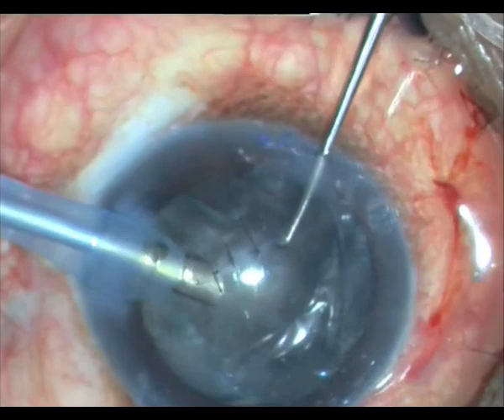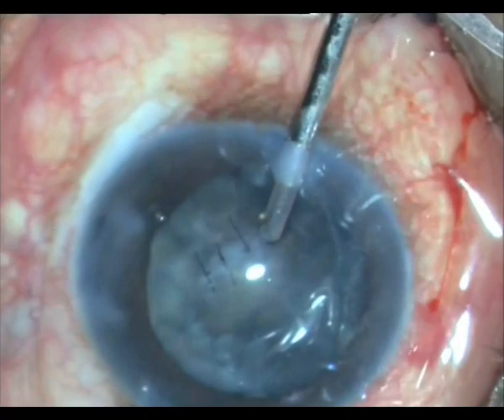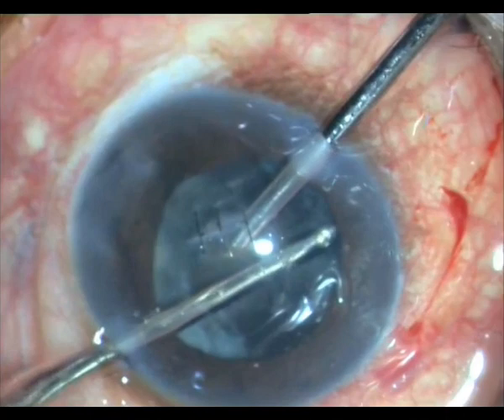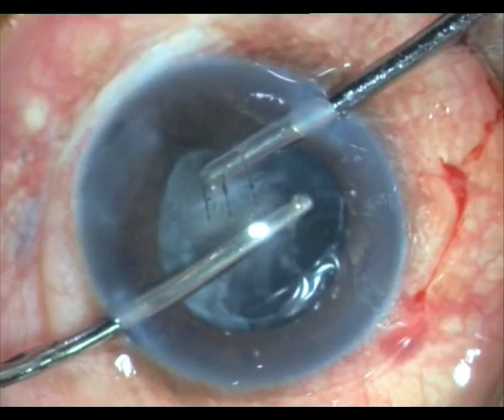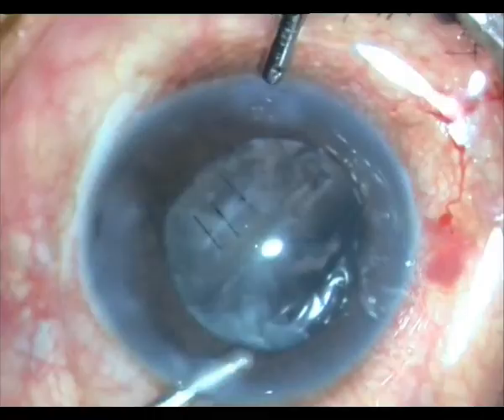There is a temptation to take out the epinucleus with the FACO probe, but I resist it. I opt for the longer but probably safer version: I use the bimanual technique to meticulously and laboriously remove all the epinucleus and cortex. I remove from the lower area first because I know the capsule is pretty stable there — nothing to worry about. I do this on the other side as well.